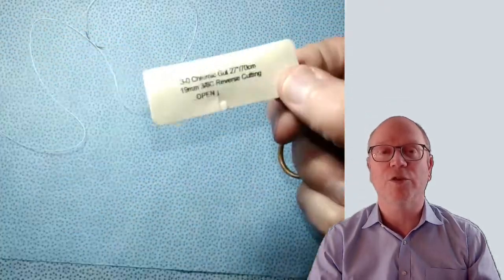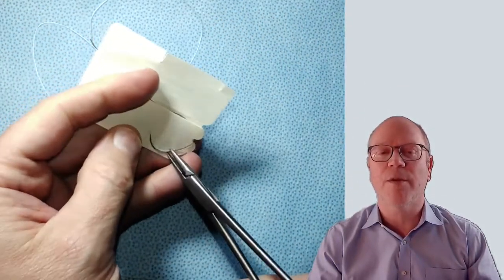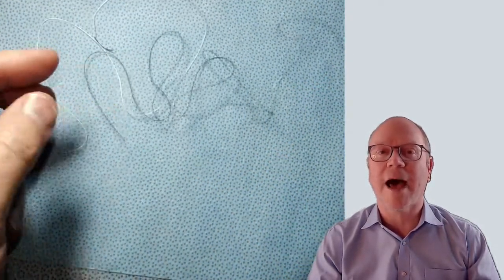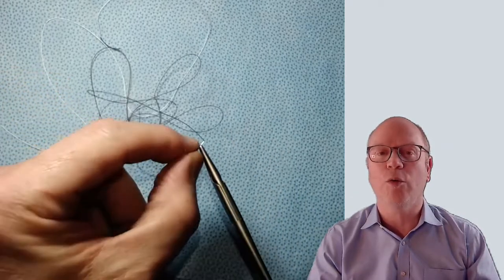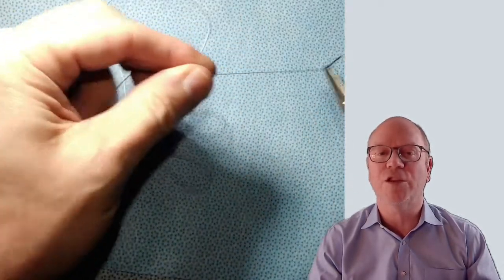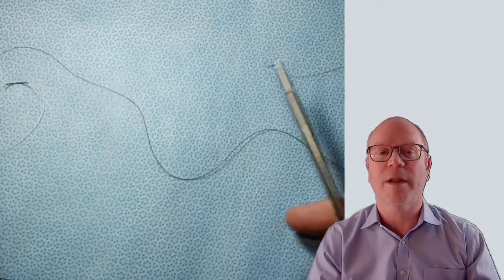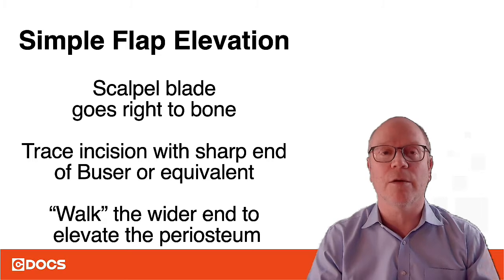Chromic is a great suture too, but very different. When you pull the 3-0 chromic out of the package, you can see how it binds up together — it's got a lot of memory. So you have to stretch it out: hold one end in your left hand and drag it through with tension. It usually takes two or three times, and you can see it gets better each time until it's ready to go.